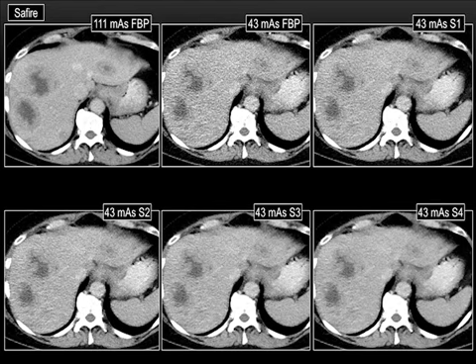So this is something which radiologists are looking for, now that they are well trained. They see that the IR is reducing noise, but they're very picky, very particular about the visibility of small structures or lesion margins. And this affects the visibility of the lesions too.